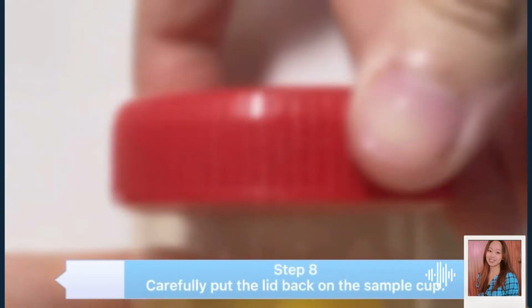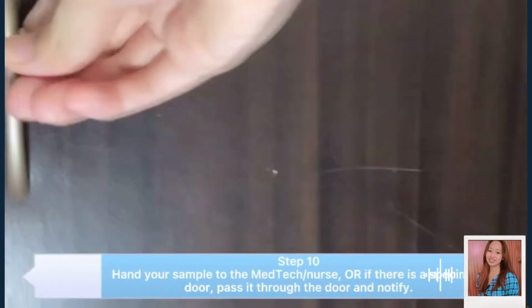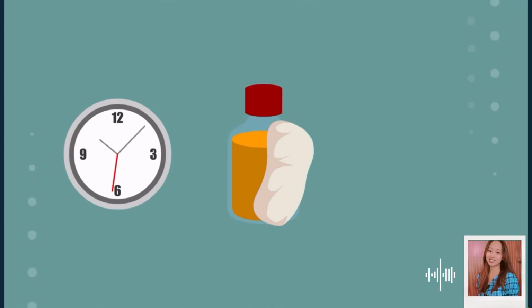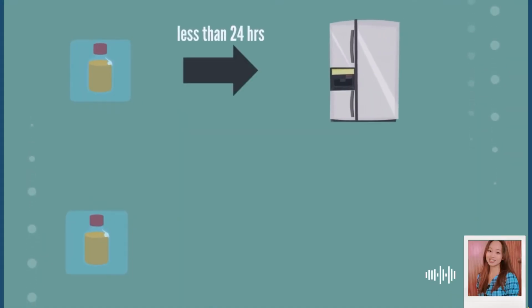Lastly, label the container with the name and time of collection and place in the specified area or hand in the phlebotomist for labeling. Bring the specimen to the lab within 1 hour of collection and store refrigerated for up to 24 hours.